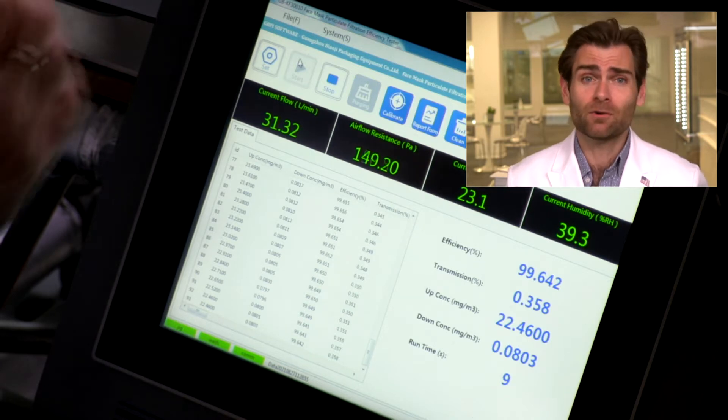Remember, we're testing just filtration here, not fit. But if it's an N95, that means the CDC and NIOSH have said the fit is good on this, as long as you follow the instructions that come in the box.